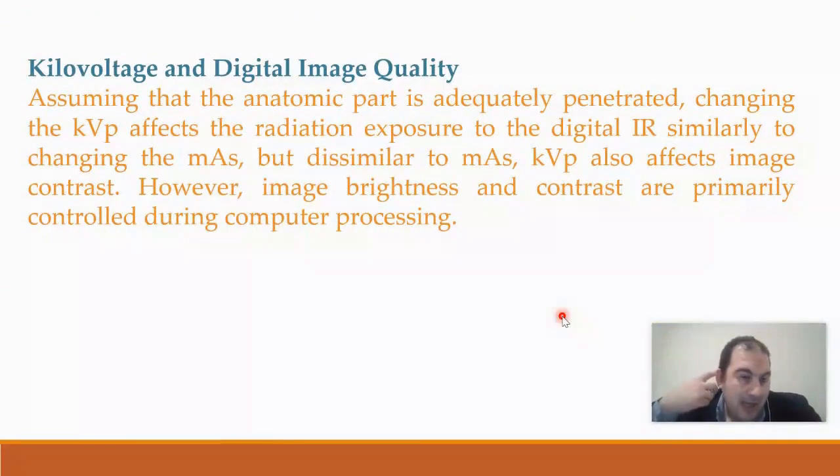The relationship between kilovolts and digital image quality means we are talking about digital radiography. If you are discussing screen film radiography, you will find that it is very sensitive to overexposure and underexposure because it has a short or narrow range of exposure latitude, as we will see later, and I do not have the option of post-processing.